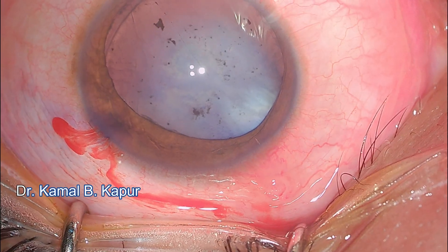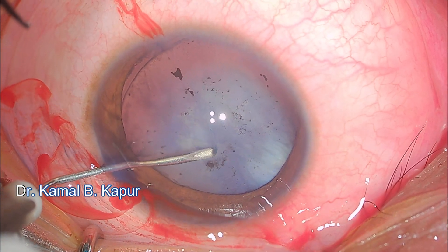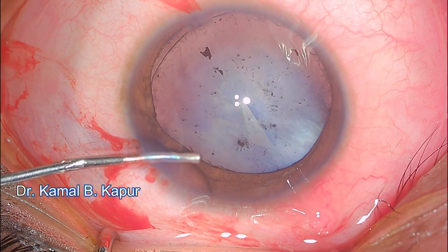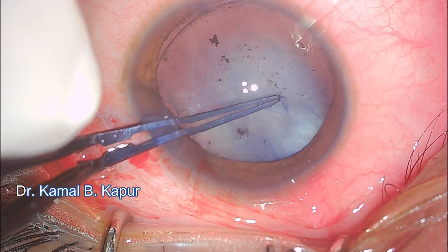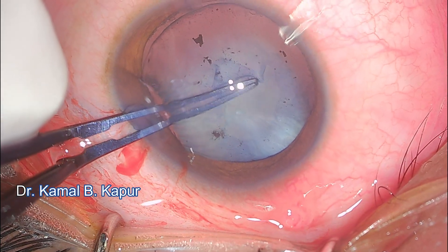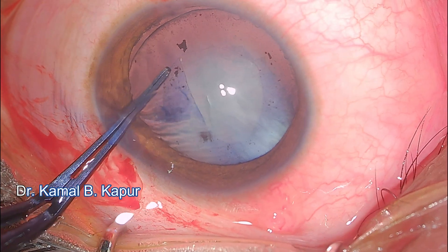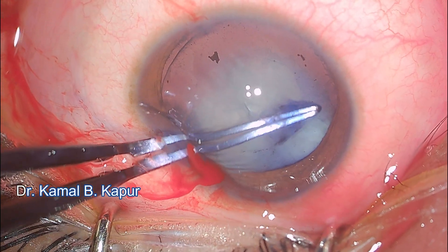In a very controlled manner we break the posterior synechiae and proceed towards capsular rhexis. These capsules can be fibrotic and brittle, so it's a good idea to create a nick first with a needle. I inflate the anterior chamber and do a very controlled part-by-part pulling of the fibrotic capsule, since a sudden jerky movement can result in a peripheral tear. I want a round rhexis to accommodate a capsular tension ring. Don't miss the area of subluxation on the inferior-superior left part of the screen — we complete the capsular rhexis very gradually.